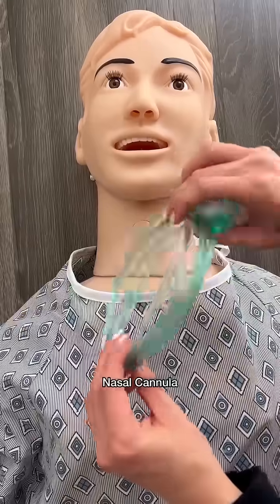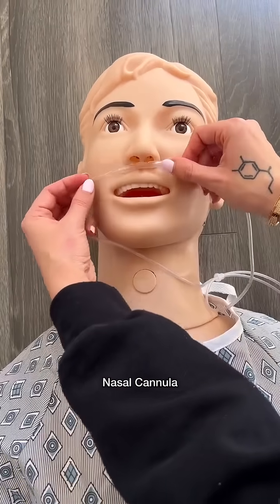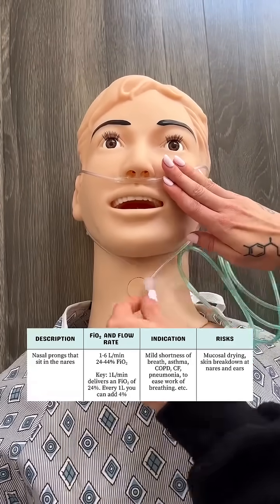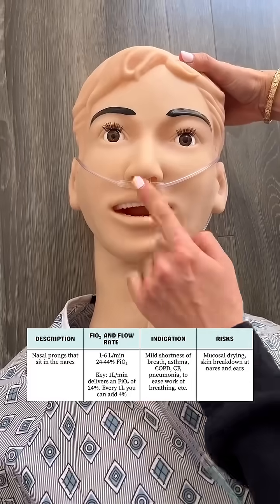First, we have the basic nasal cannula. These are little nasal prongs that sit inside of the nares, used for mild conditions, mild shortness of breath, asthma, COPD, to ease the work of breathing. Risks are minor: skin breakdown and dryness in the nose. You can use a humidifier if needed.